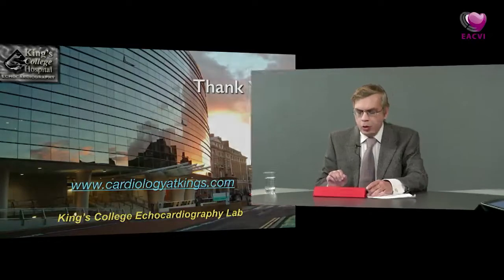Should MI be low also in dipyridamole perfusion imaging? Yes. So when we're doing dipyridamole, we're actually not looking at wall motion. We are actually looking at perfusion. So in order to see the contrast within the myocardium, we do need to use the low MI setting. But as I showed you, we're going to use the flash imaging as well. So it's going to be a combination of doing the low MI imaging to look at the contrast in the myocardium, firing 7 to 10 frames in rapid sequence of high MI to clear it out, and then watching the replenishment on the low MI imaging. So most of the imaging will be done in low MI.